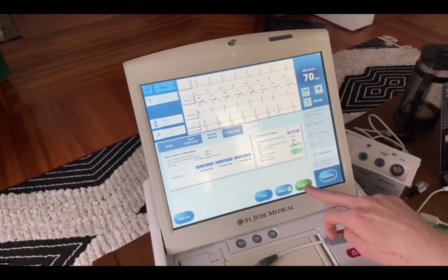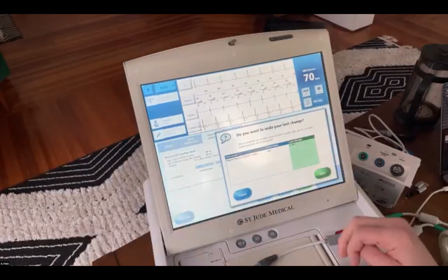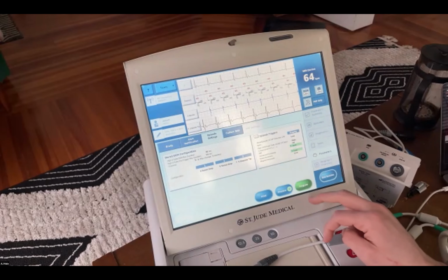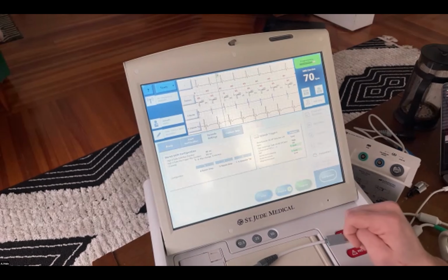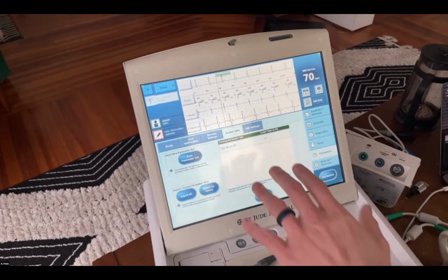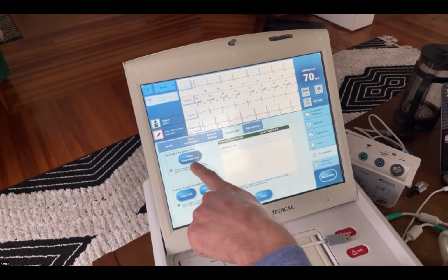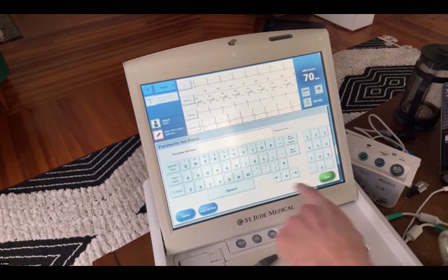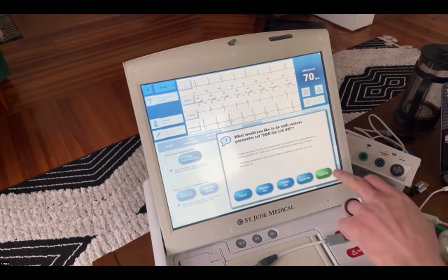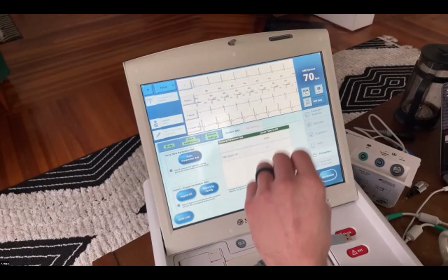So here's where you'll go and you can either program there on that screen or program. If you don't like those programming settings, you can undo all or undo last. It will undo the last setting that you changed. Under preview, you have the ability to undo all of those changes that are highlighted as well. Finally, custom sets. You may have a custom set already created. If not, you can save a new parameter set and it will give you the option to name it. But in this case, we want this one here. We can load that custom set and it will load up everything based upon that custom.